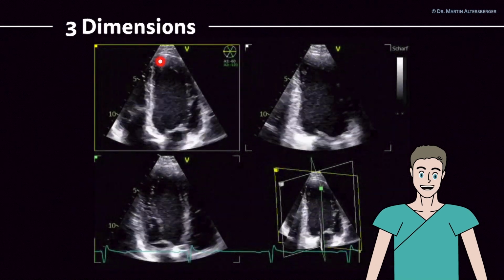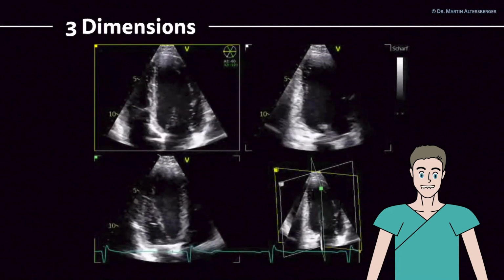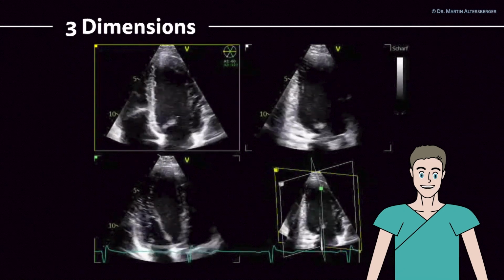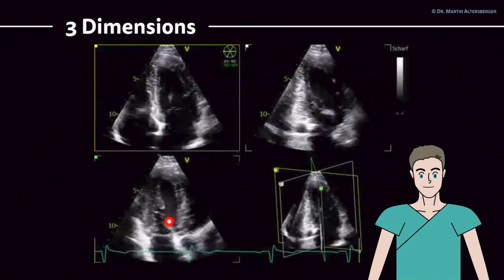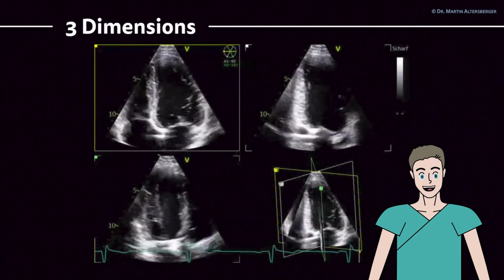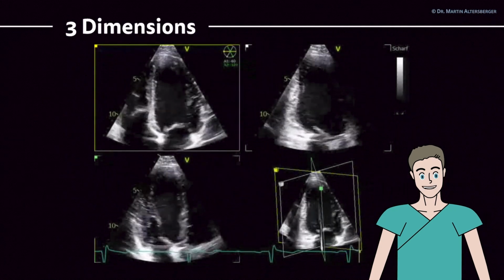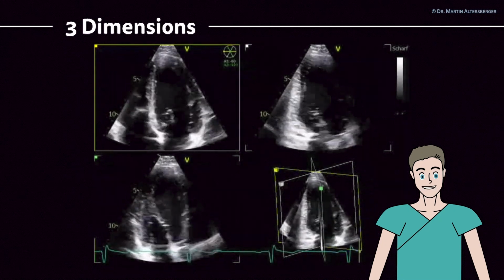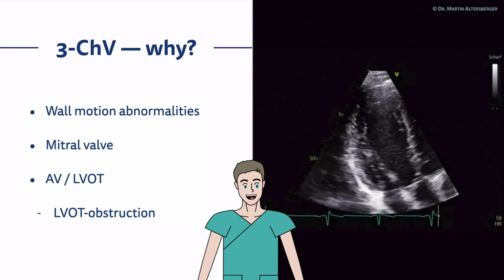Here we have the four-chamber view in these three plane modes, the two-chamber view. Here already the aortic valve comes in our field of view, so it's in between the 2 and the 3 chamber view, the apical long axis view. And here long axis view, where you already are a little bit over-rotated towards the right ventricle. But with this modality, you can easily visualize the various views of the left ventricle easily.